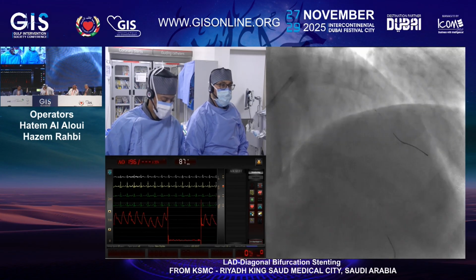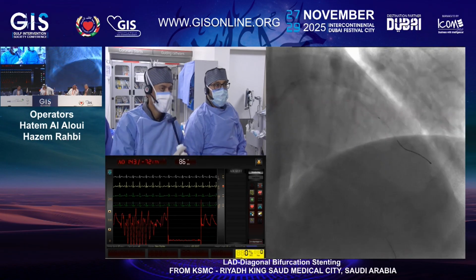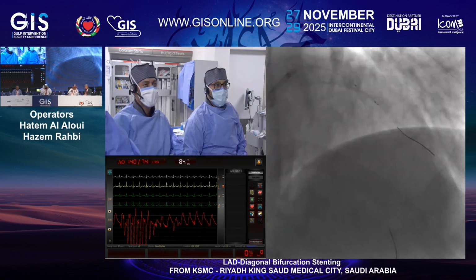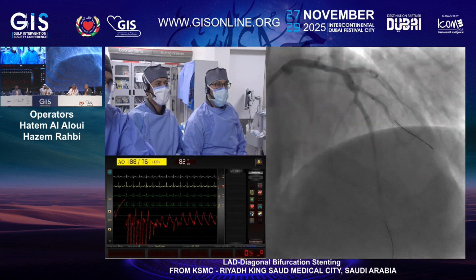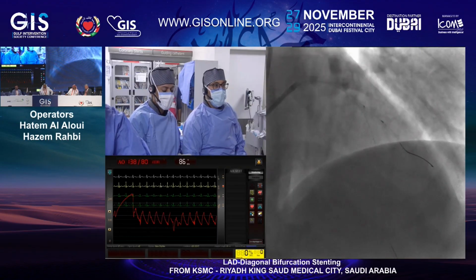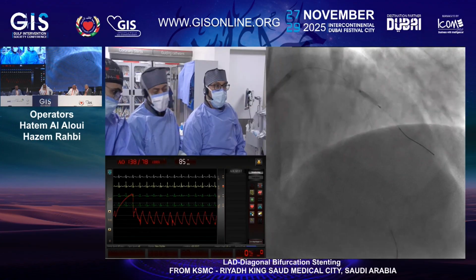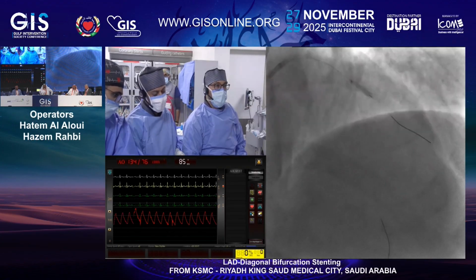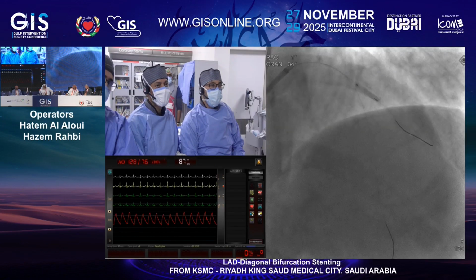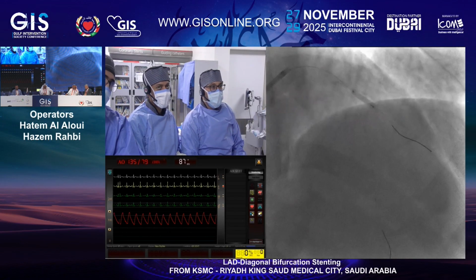What's your strategy if, after using the NC balloon, there was a distal dissection? What are you going to do? It depends actually on this dissection. If it is a bad dissection, with dye staining and slow flow, I will try to go nano crush, even though the angulation is not really very good for a nano crush.